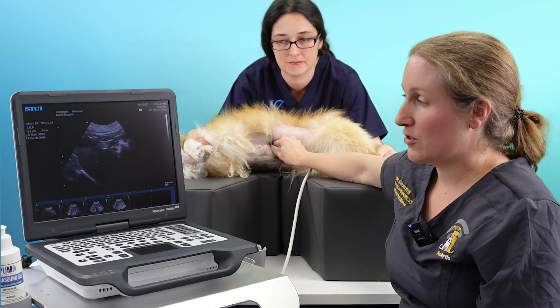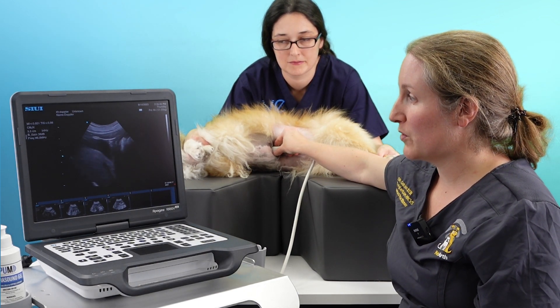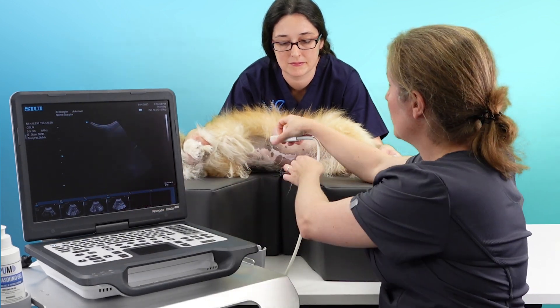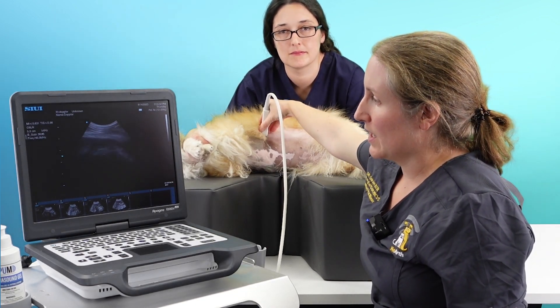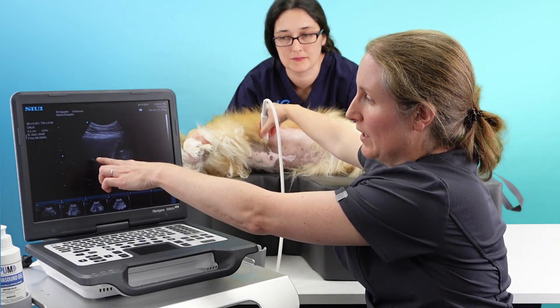We've seen almost the entire liver here, but possibly not the very dorsal portion, which is disappearing off the screen. So I'm going to move the probe dorsally and scan between the ribs to see if we can just see the very top of her liver — and we can see it coming in here.